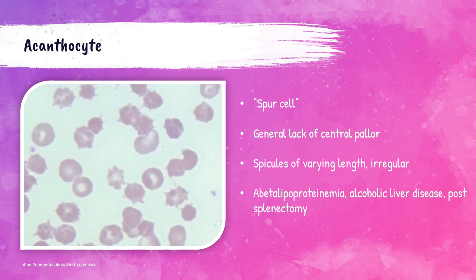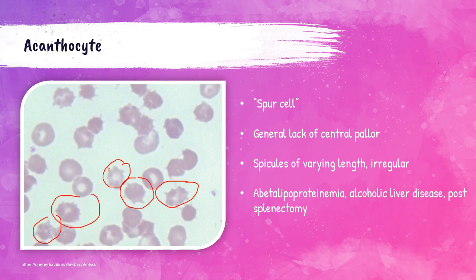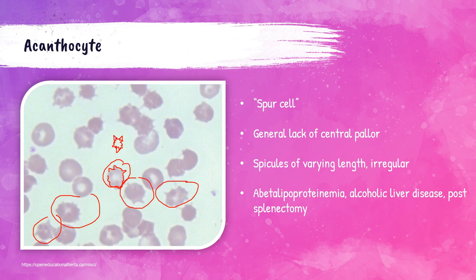As you can see, acanthocytes are very similar to echinocytes, but their projections are not as uniform — the spicules are sporadic with varying lengths and spaces between them, where an echinocyte would have spicules of the same length all the way around it.